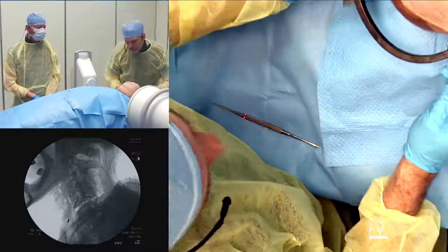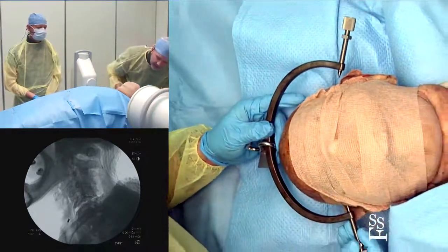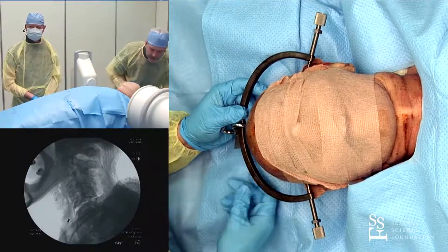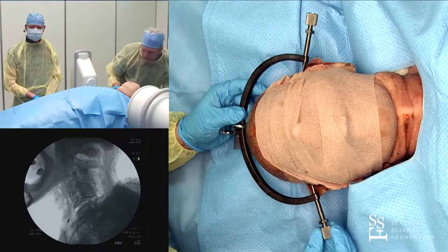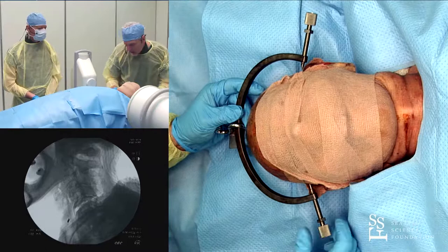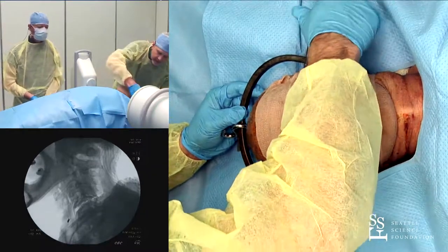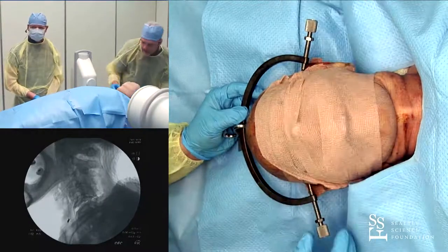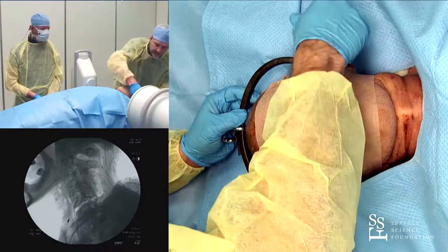Let's go ahead and put this on. Make sure you have plenty of room above the patient so you can move side to side. I'll start tightening down one side and then symmetrically tighten the other, doing both almost simultaneously to get the pins seated down.